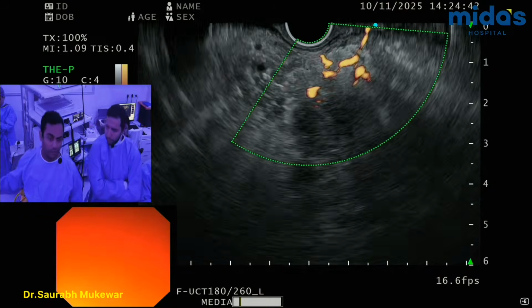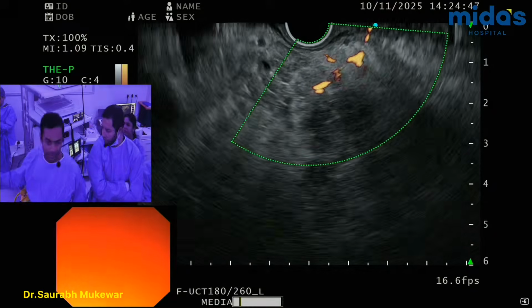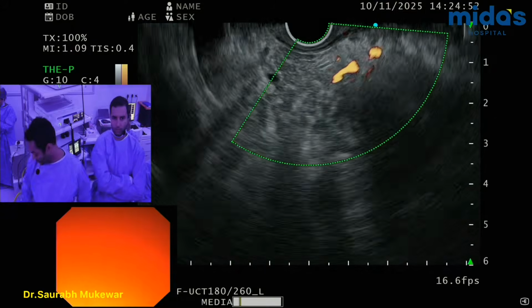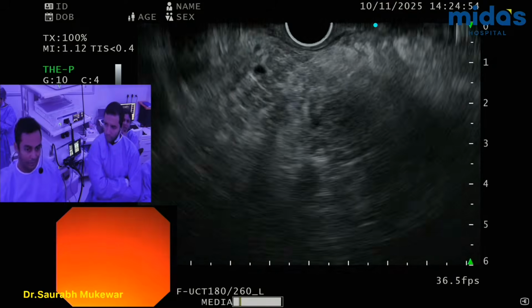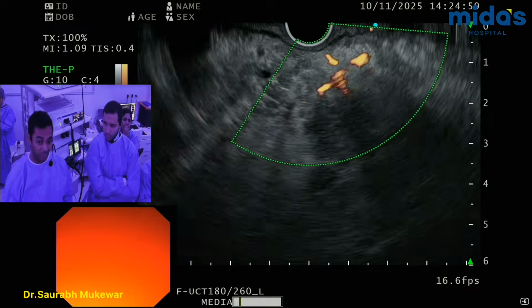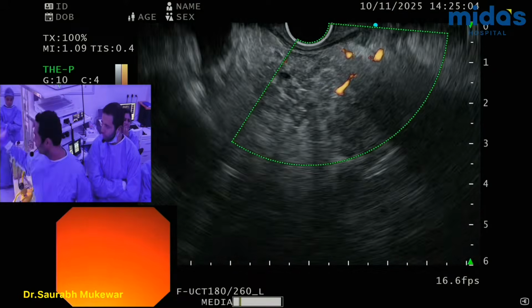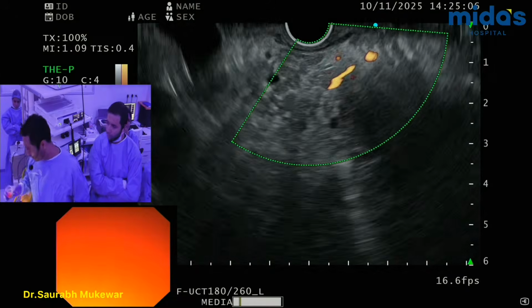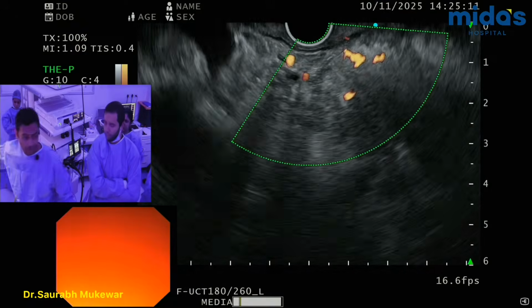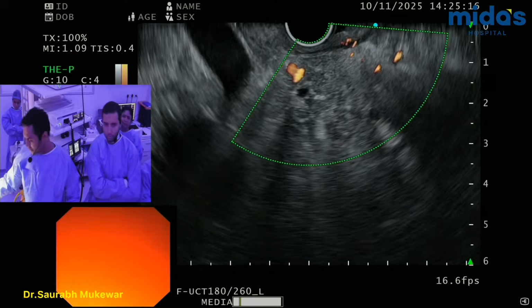Yeah, I didn't want to bother with the cytology because there's a limited sample. We'll get the histopath to be able to characterize a serous cystic neoplasm based on the appearance on the histopath. Because you're not looking at malignancy, cytology for me is of no use. I don't think they'll be able to diagnose SCN based on a cytology, right? They'll need more histopath. So if you have only two limited passes with all these blood vessels, I would focus more on getting the tissue for histopath so that they can make a better judgment of this. So that was the idea behind not doing it.